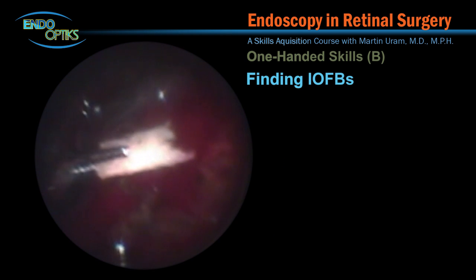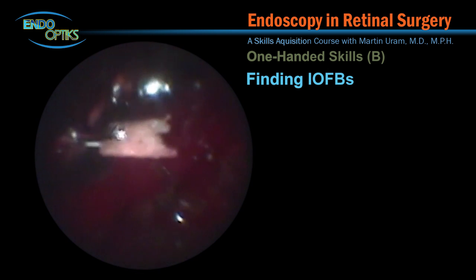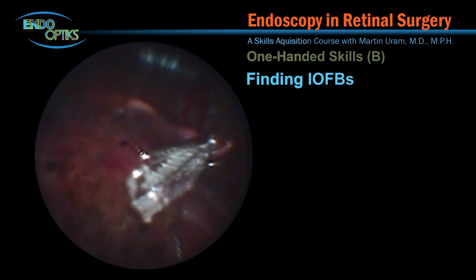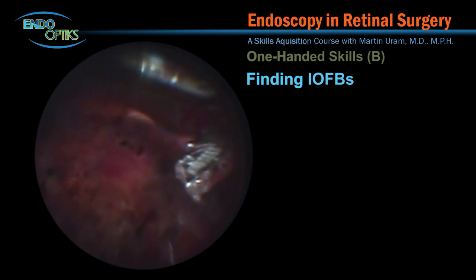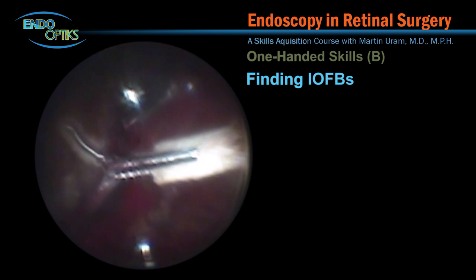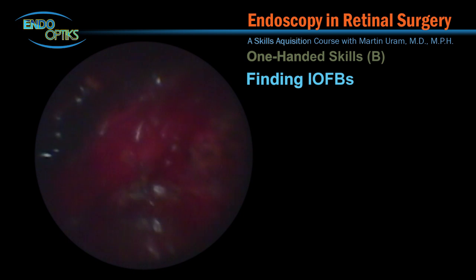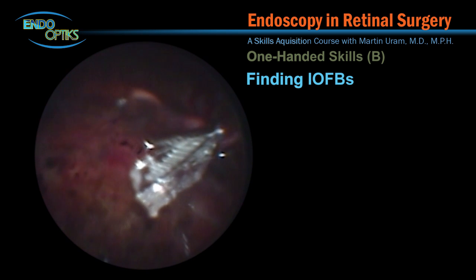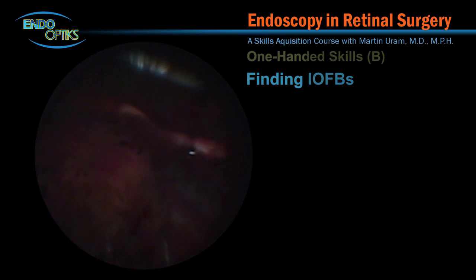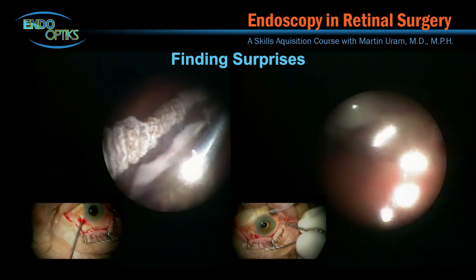Endoscopy is a great tool for finding things inside the eye. In those with opaque media, ultrasound or radiologic techniques may indicate that a foreign body is within the eye, but from a surgical perspective, they do not define exactly where it is. In the presence of significant intraocular disruption, this can be particularly daunting. This one-handed technique rapidly and effectively locates intraocular foreign bodies and permits endoscopic monitoring of their removal with a forceps or other instrument. Endoscopy is also useful for finding surprises in the eye.